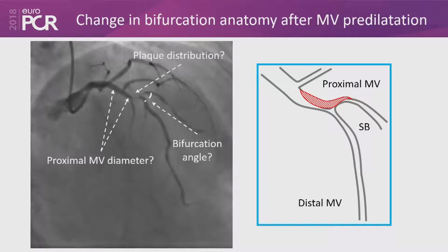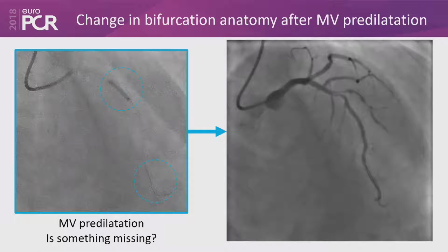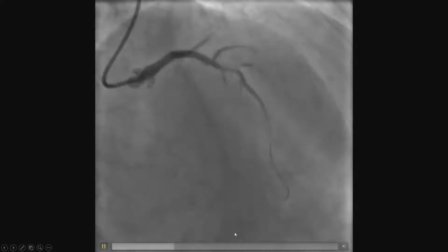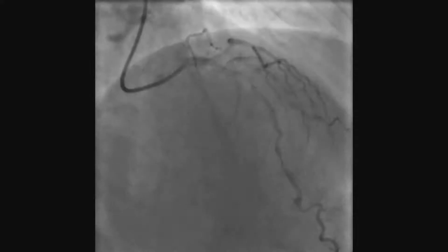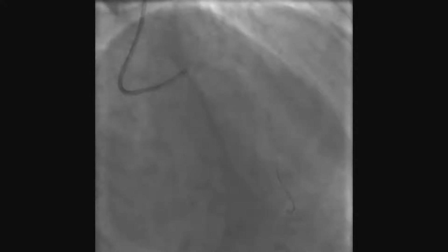And I was wondering why you chose a two-stent strategy in the first place, and making the question a bit broader: are there any guides for us to understand what an important side branch really is? A certain diameter or a certain length of disease at the ostium?